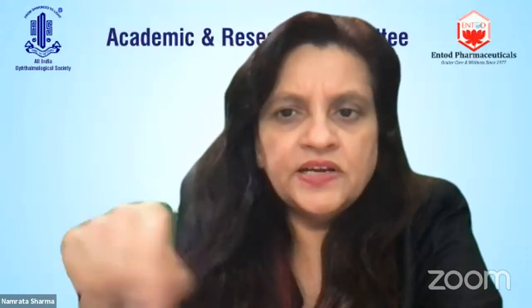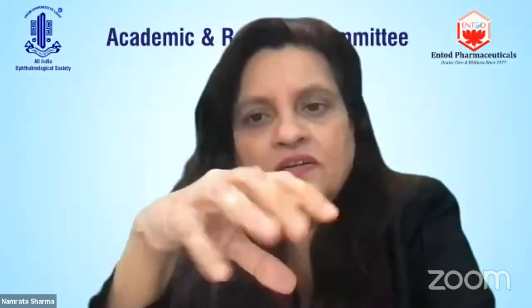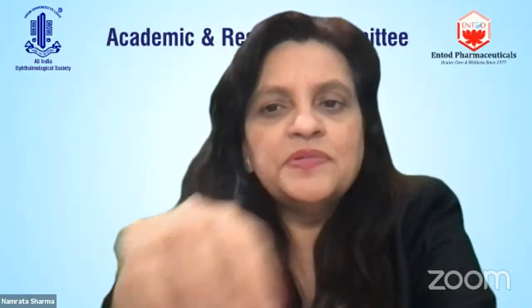I have two questions for you, Suresh. One is this hard brown cataract: you are bringing it anteriorly to the iris plane, and sometimes you're closer to the endothelium than normal. Second thing is the phaco energy. Can phaco energy damage the IOL? You don't know what micro damage is occurring to those lenses. Yes, that's a very valid question, Dr. Mohan.